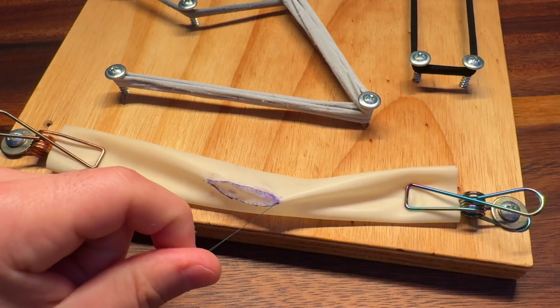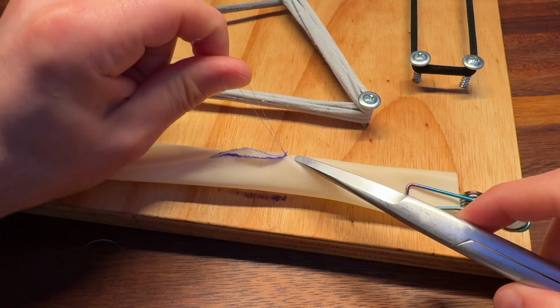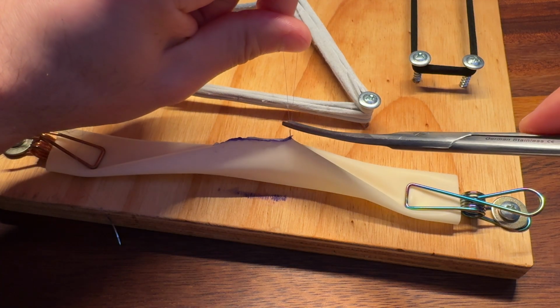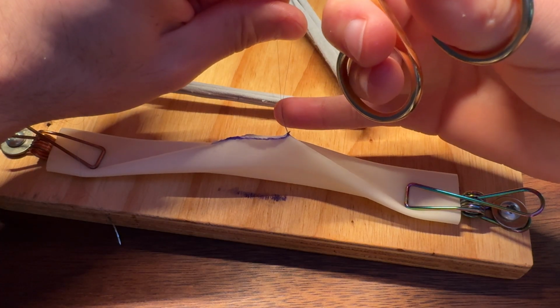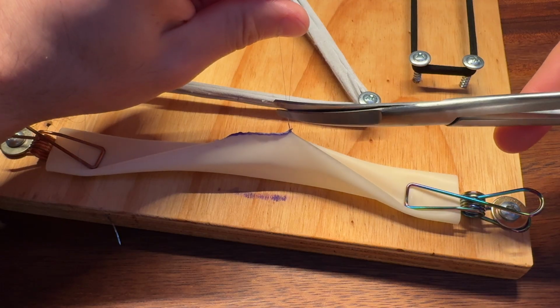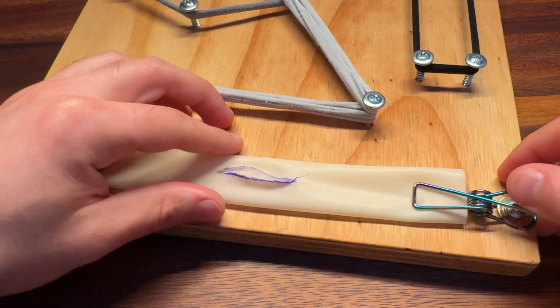So at this point, go ahead and leave a bit of a tail, because since it's a monofilament, it's going to slide, right? So you do want to be somewhat generous with the tail, maybe a little bit less than a centimeter. Again, a pinky is about a centimeter, so somewhere around there. Twist, that looks good, and I'm going to cut there. All right, finished product.